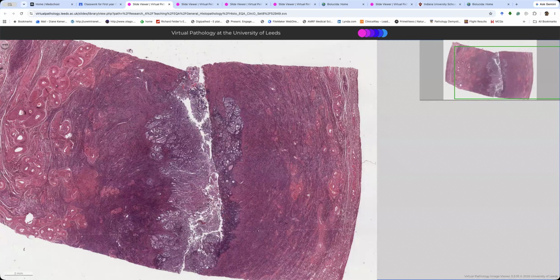Ah, so Adam, you've put "must invade." So this is quite nuanced. If it is invading, it's definitely cancer, but you can get intraendometrial adenocarcinoma as well, where it's not invaded. It's still in the endometrium, and sometimes it doesn't have desmoplasia. But if you follow the gland complexity, the string sign, the 2 millimeter size, and the context, you'll mostly get it right.